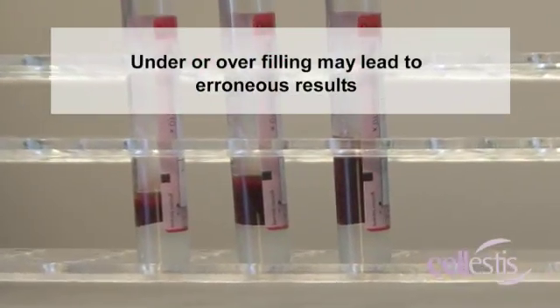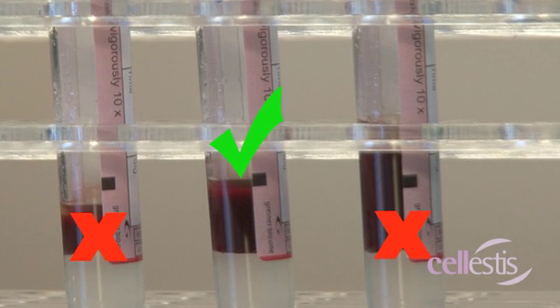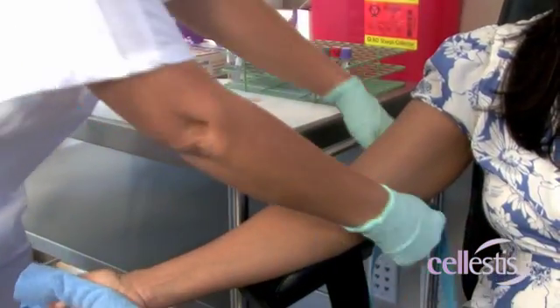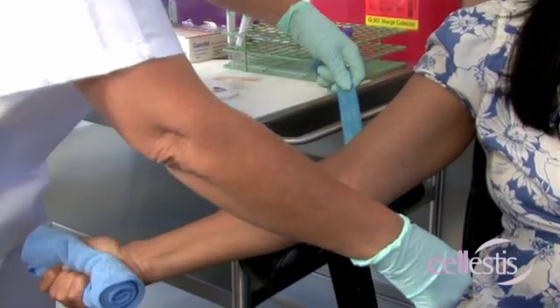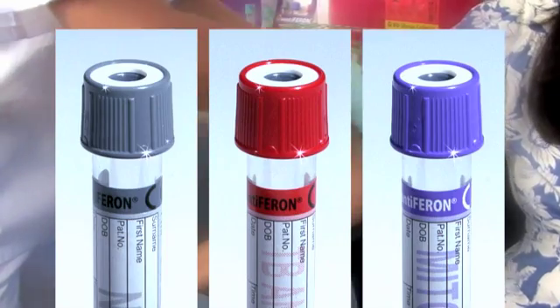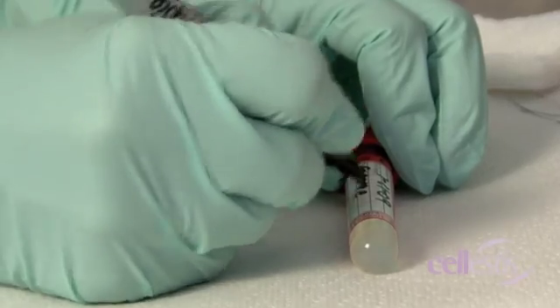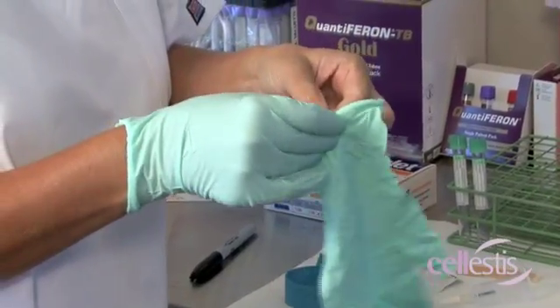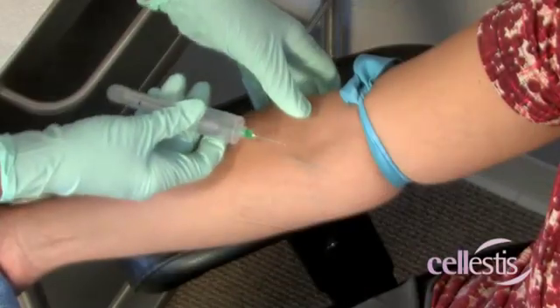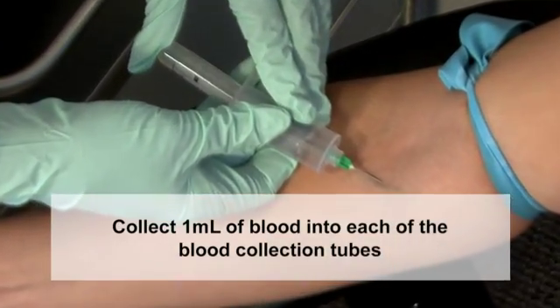Under or over filling the tubes may lead to erroneous results. There is no specific order required for blood collection; however, a commonly used fill order is nil, TB antigen, followed by mitogen. Collection and individual identification details are to be recorded on each of the tubes. Standard blood handling precautions should apply during the blood collection process.